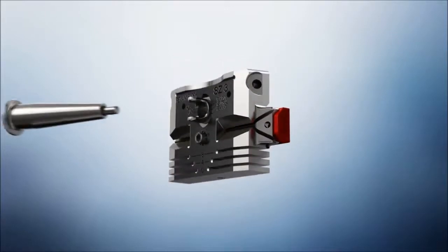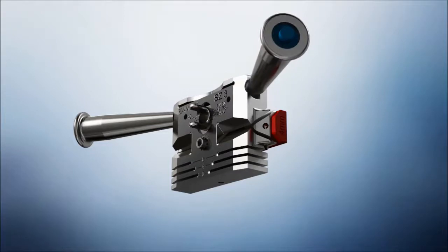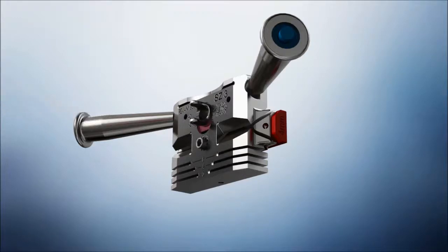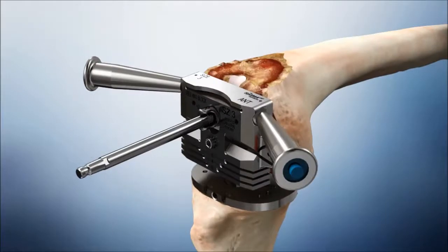The removable handles may be assembled to the revision 4-in-1 cutting block. Set the block to the correct AP starting position by inserting the HP revision screwdriver into the hex head on the block, push and turn to adjust. Prior to pinning, this same motion may be repeated during the procedure to adjust the placement of the block. Additionally, be certain that the correct left or right L or R setting is facing to the top on the knob. Slide the block onto the removable shaft with the appropriate L or R orientation on top.